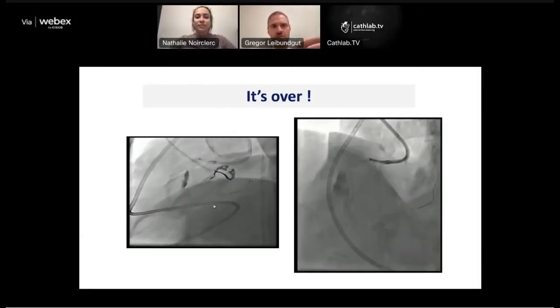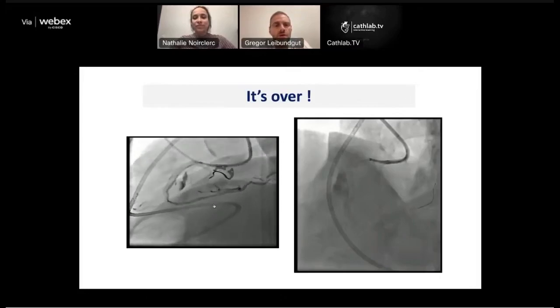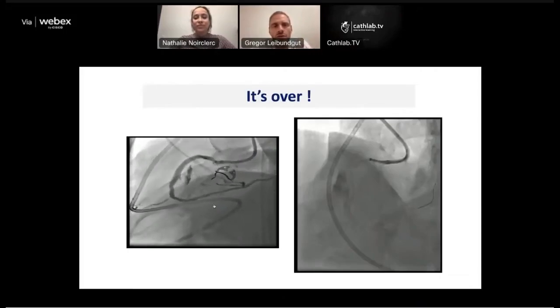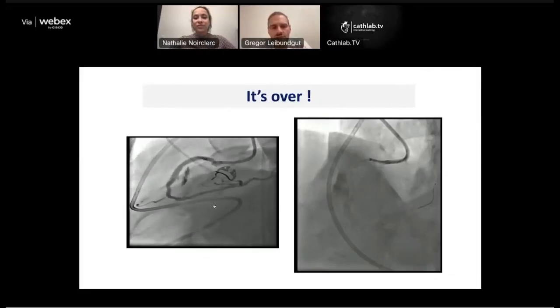You might have a 5.0 vessel and only have a 3.5 available. Make sure you know to what maximum size you can inflate them, because if you estimate the vessel too small, then you have the endoleak, and then you cannot overexpand it without rupturing the PTFE membrane, and you're in big trouble. So these are things to remember.